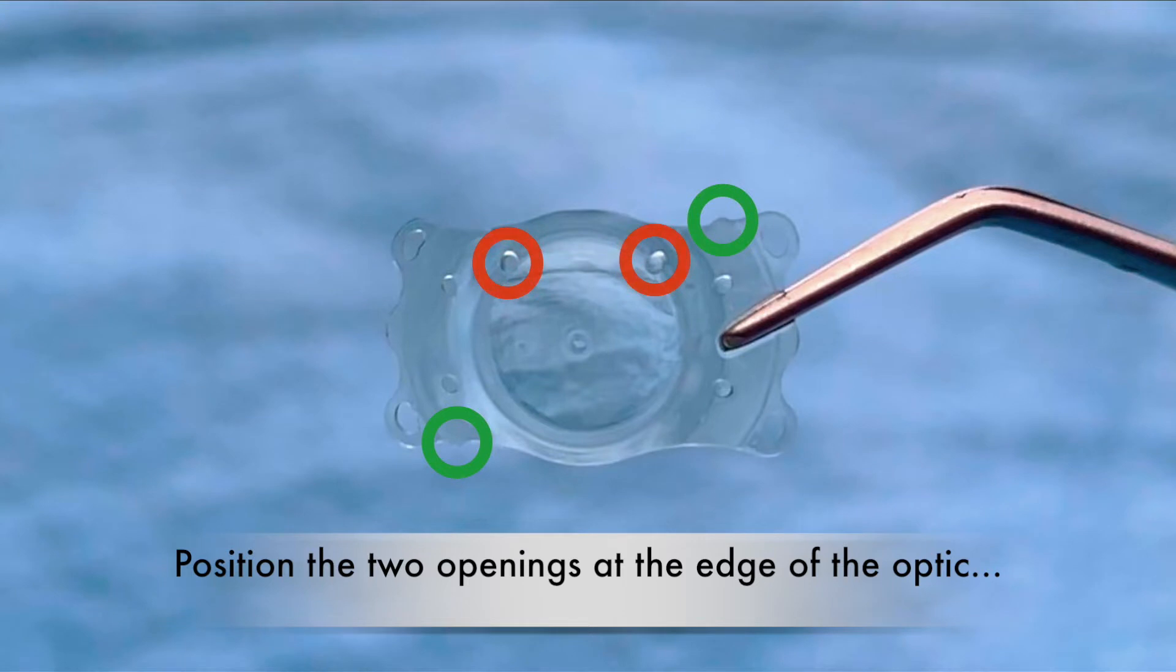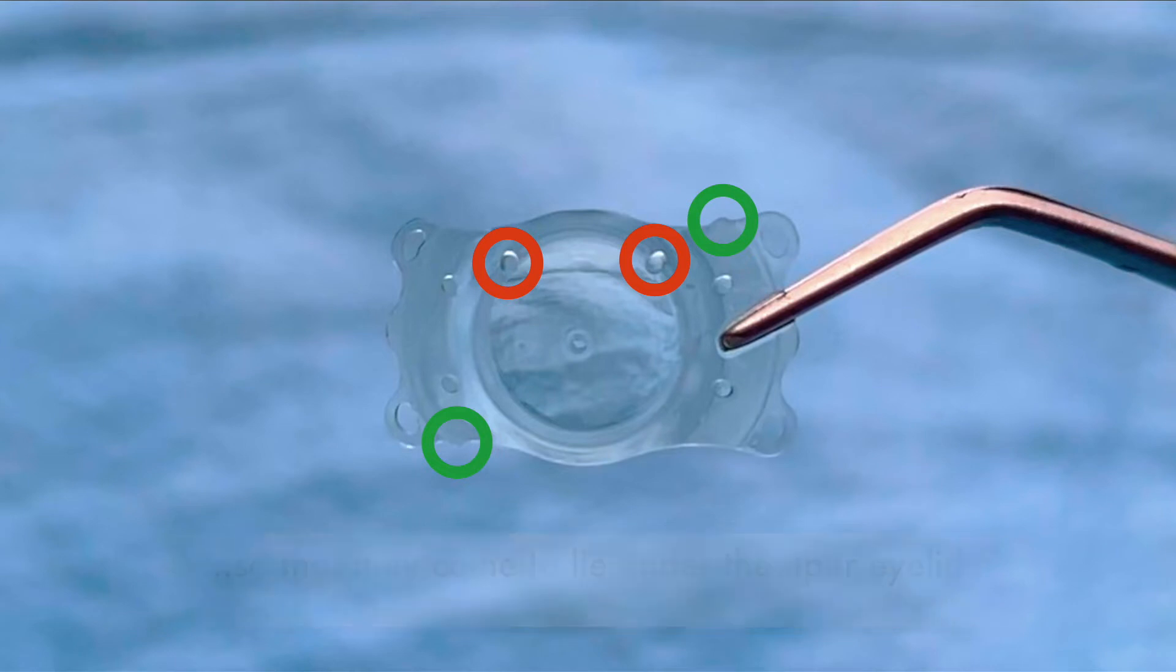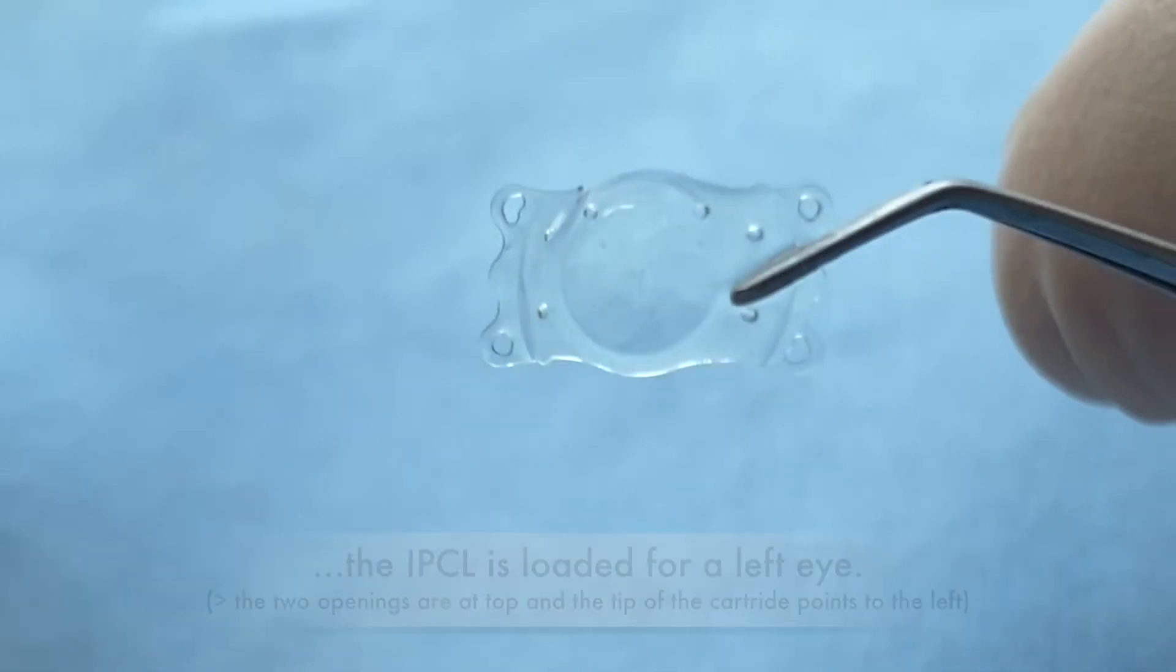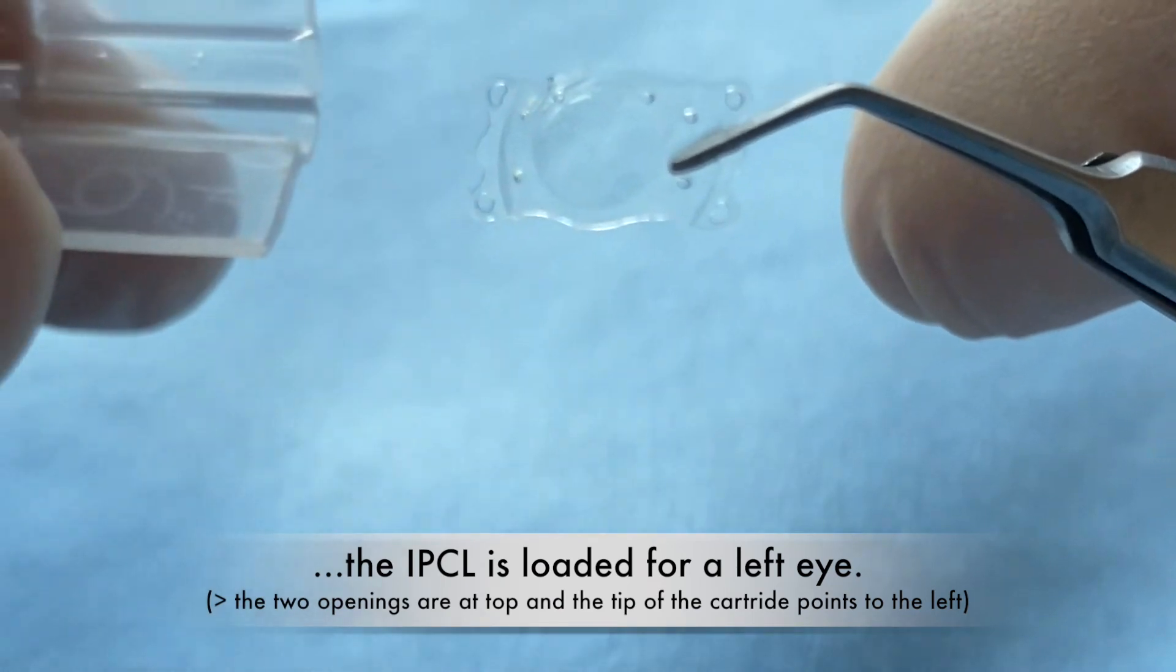Position the two openings at the edge of the optic so that they come to lie under the upper eyelid. In this example, the IPCL is loaded for a left eye.